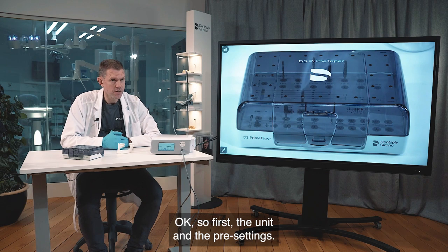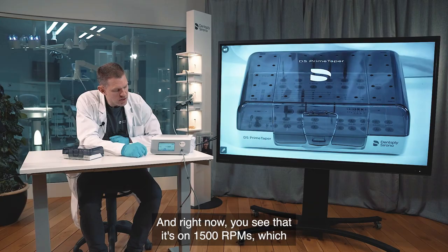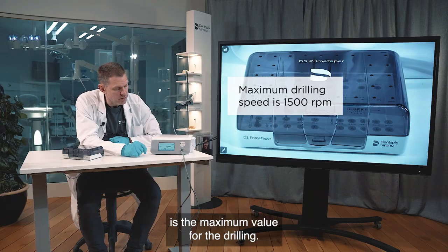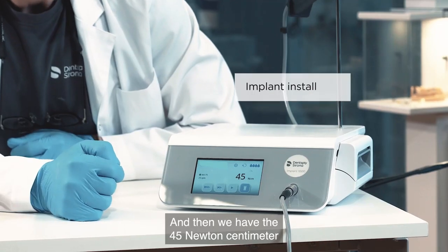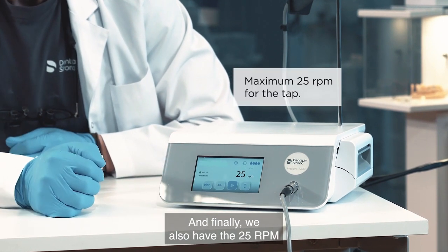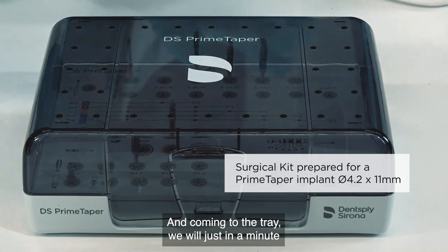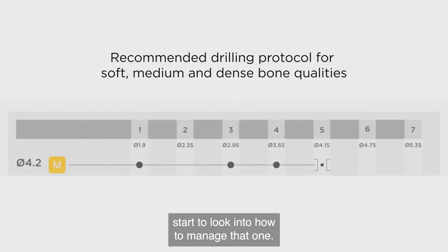First, the unit and its pre-settings. Right now you can see it's set to 1500 rpm, which is the maximum value for drilling. Then we have 45 Newton centimeters as the maximum installation torque for the implant, and finally 25 rpm for the tap, which we will show later. Now let's look into how to manage the tray.